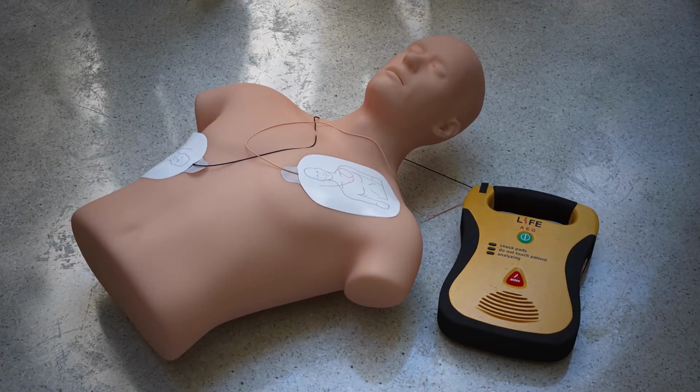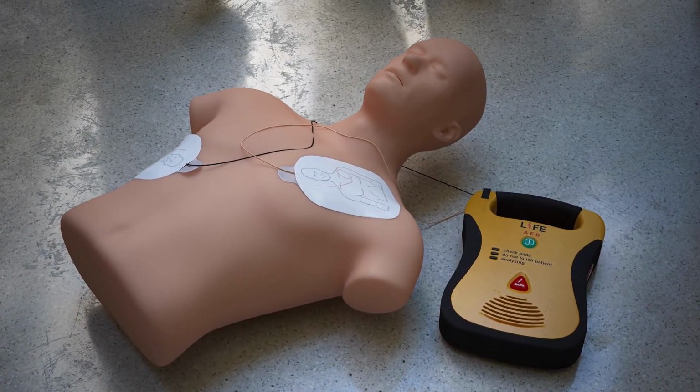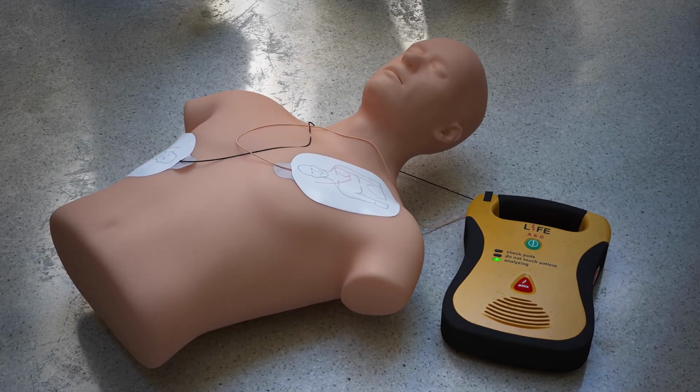So the good thing about AED machines and technology we have today is you can't accidentally hurt someone using them. They're extremely safe to use. Two steps to use them. Number 1, you turn the device on because they're audibly prompted. They're going to talk you through the steps in use. And number 2, they have visual displays, right? So they have pictures, they have images, all these other things that we can use to safely and effectively help restore that normal cardiac rhythm of an individual experiencing a cardiac emergency, right?